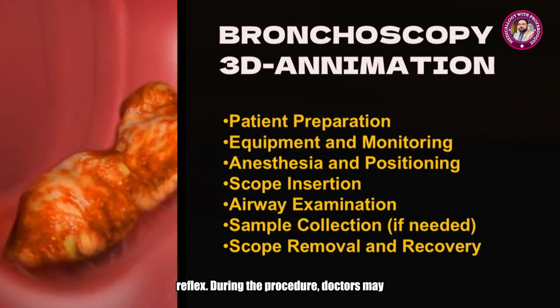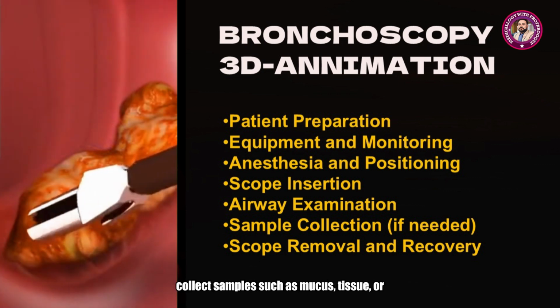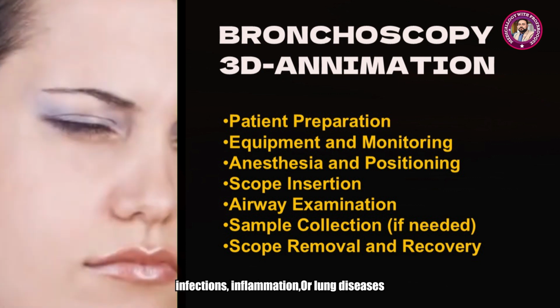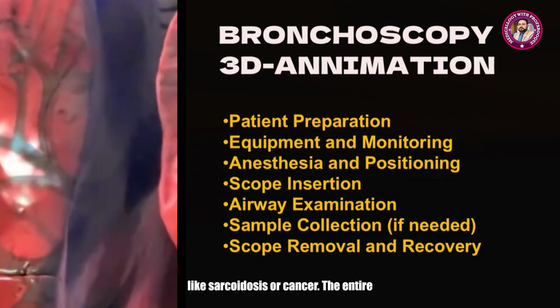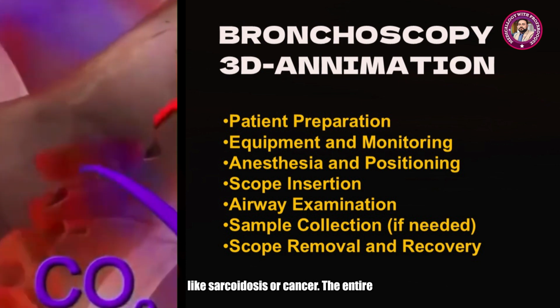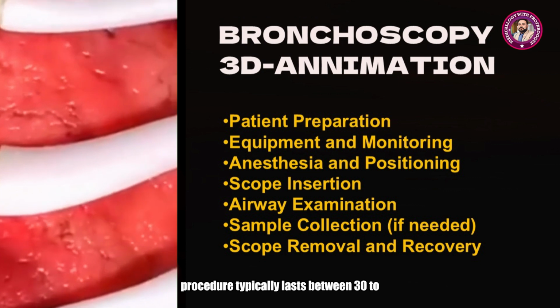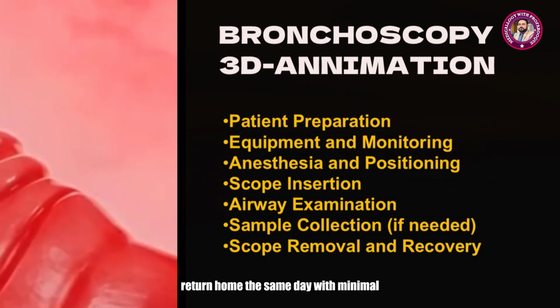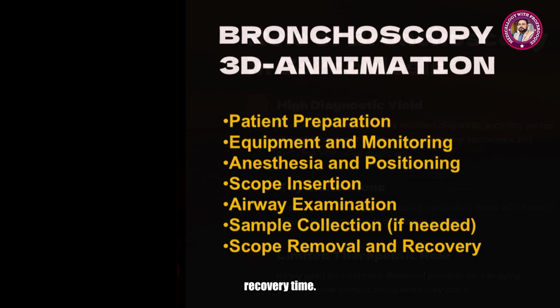During the procedure, doctors may collect samples such as mucus, tissue, or small biopsies to help diagnose infections, inflammation, or lung diseases like sarcoidosis or cancer. The entire procedure typically lasts between 30 to 60 minutes, and most people are able to return home the same day with minimal recovery time.